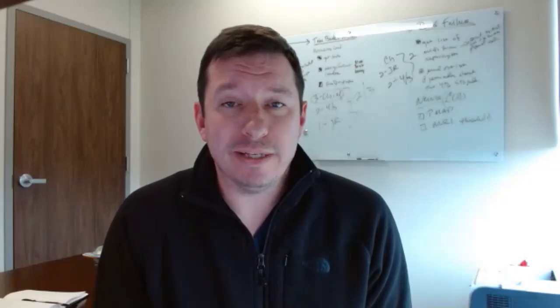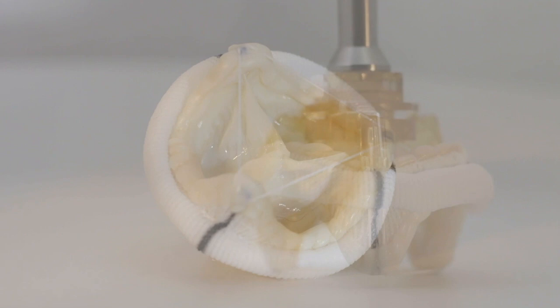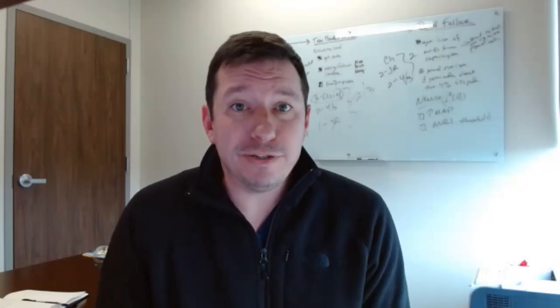Dr. Smith, this is fascinating. Let's talk a little more about that. How have the next generation valve replacement devices enabled you to perform these mitral valve replacements robotically? As we've really advanced the way that we get to the heart, now we're in the robotic stage of things. The valves themselves had to improve over time in order to allow us to get them through the small rib space that's there to minimize chest wall trauma.